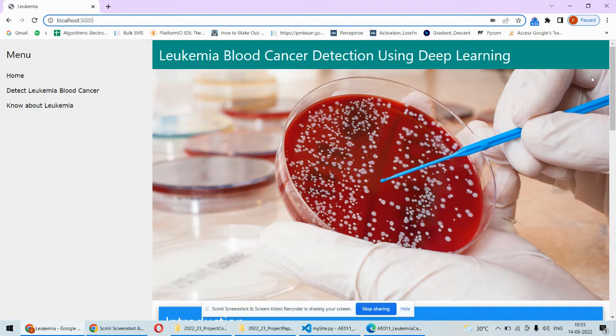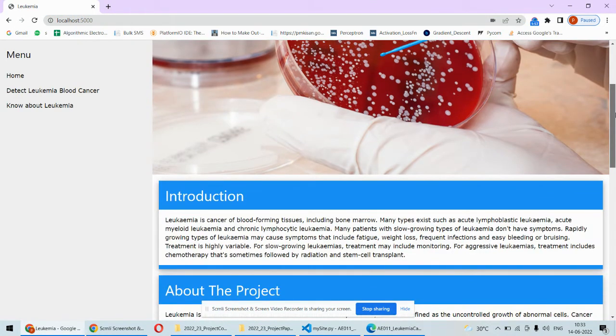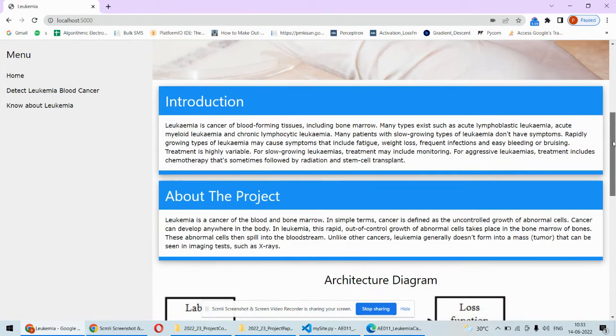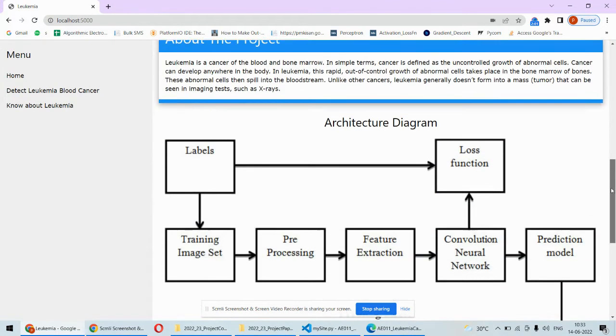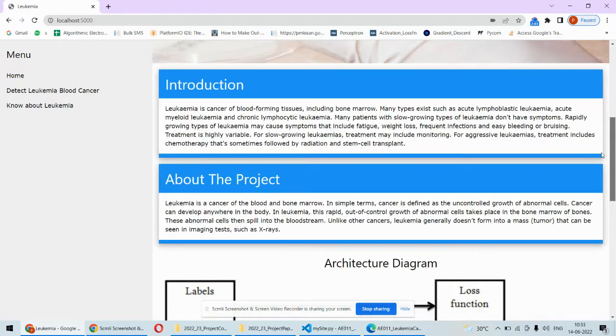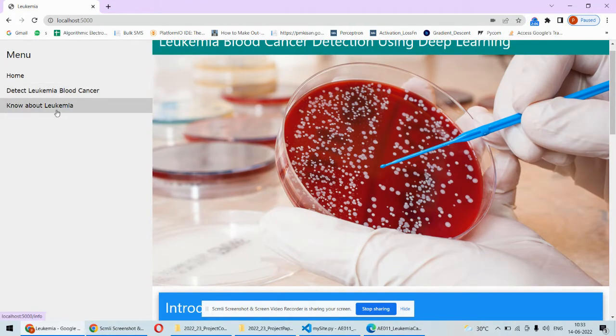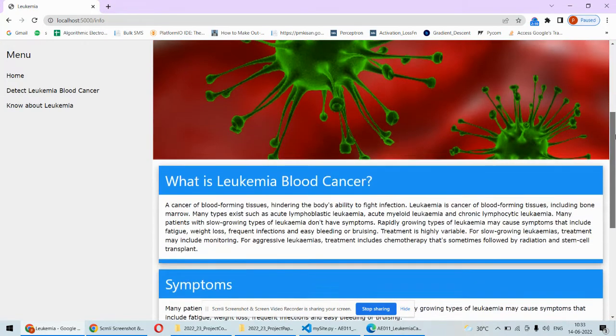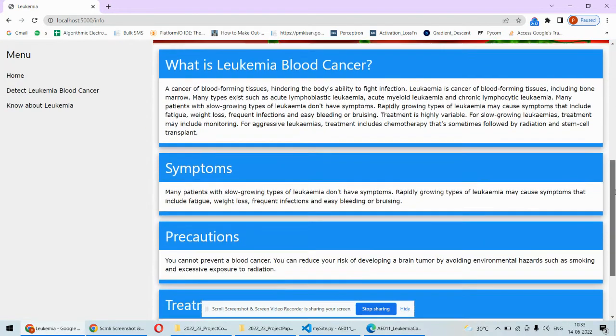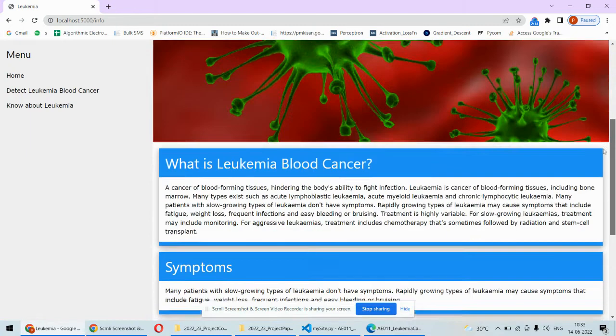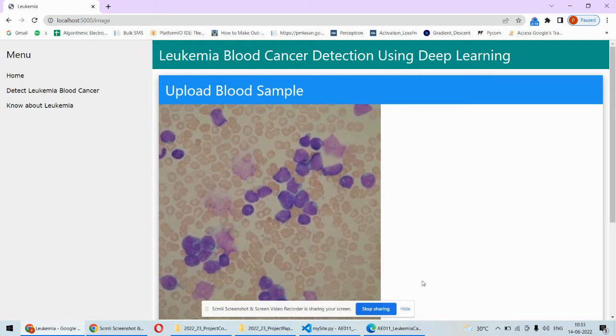The first page is the home page where we have the introduction about the project, architecture diagram, and other stuff, and then this is another important page. This is again a static page where we have some information about the symptoms and precautions. These are static pages; you may add multiple events. The main page is this where we will have to upload the blood sample.